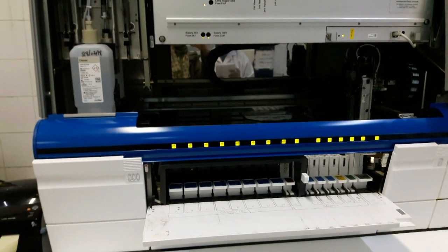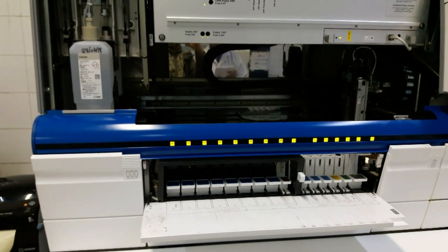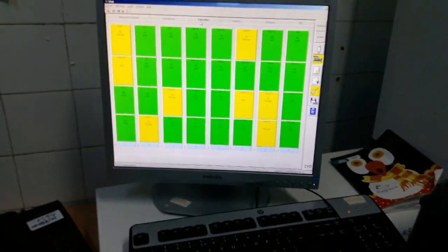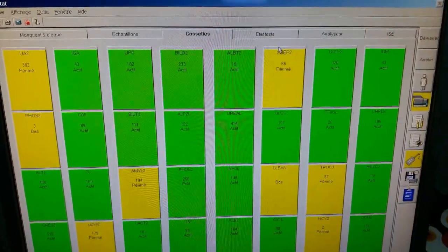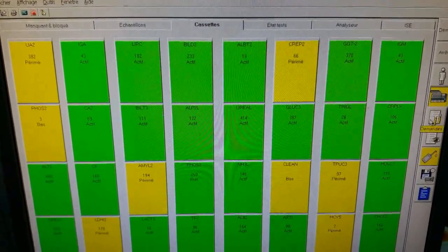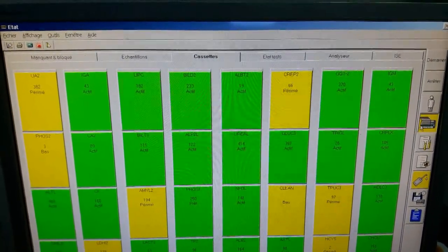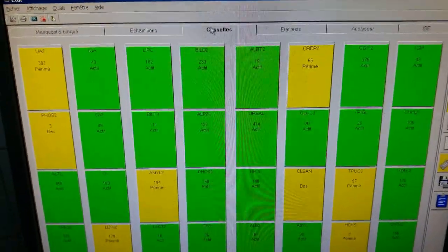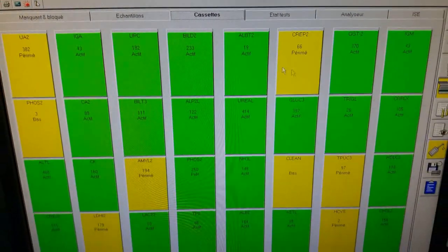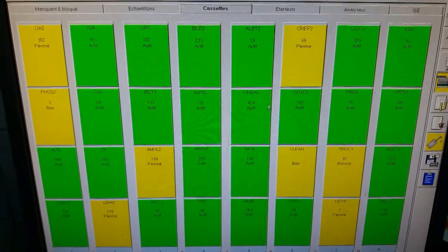Il faut s'assurer qu'il y ait assez de réactifs pour les différents paramètres biochimiques. On regarde sur l'écran. L'interface du logiciel Integra se présente ainsi. Il y a neuf icônes à droite et six fenêtres pour l'icône de l'analyseur. Il suffit d'appuyer sur la fenêtre cassette pour voir tous les différents réactifs et les différents tests, le nombre de tests que contiennent les cassettes.